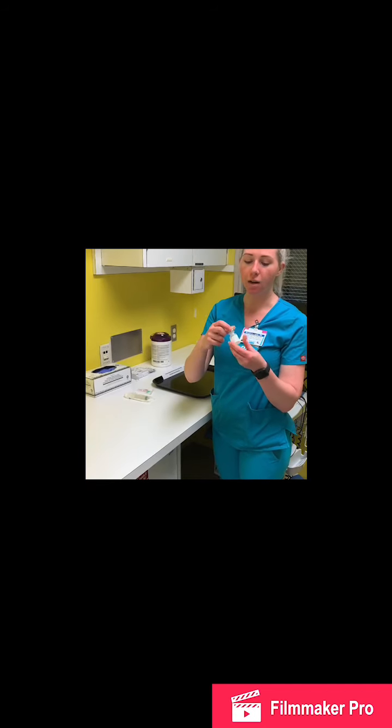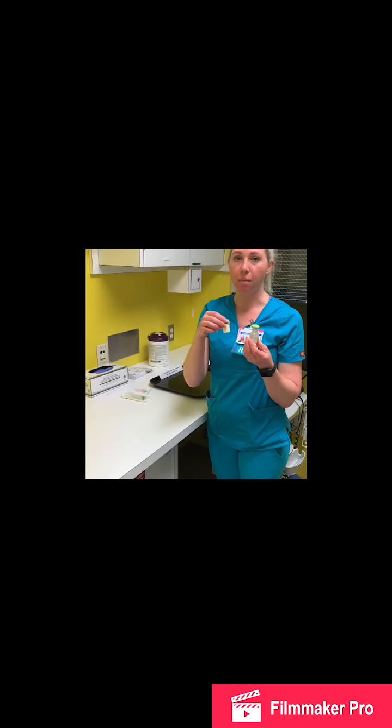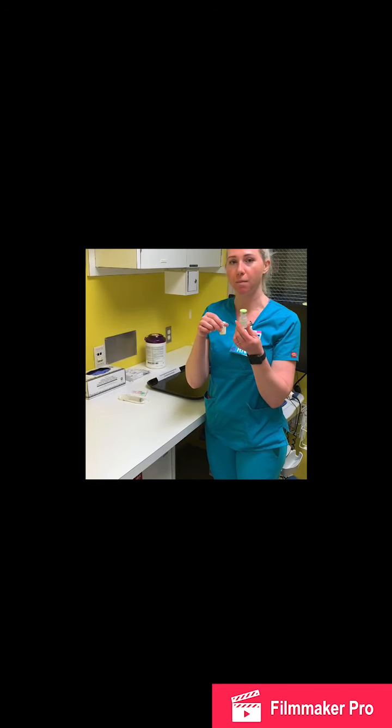So I have here my diluent and I have my medication. I pulled them out of the Pyxis. They will come as kind of a package deal. So when you type the medication in, the diluent, if it is applicable, is going to pop up with it and you'll be able to move them both from the Pyxis.